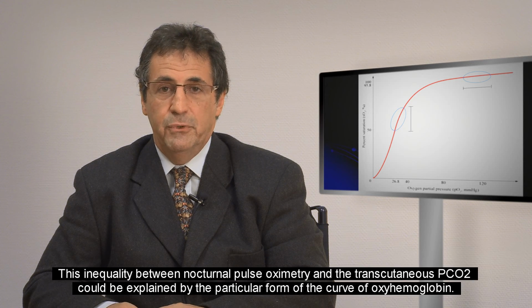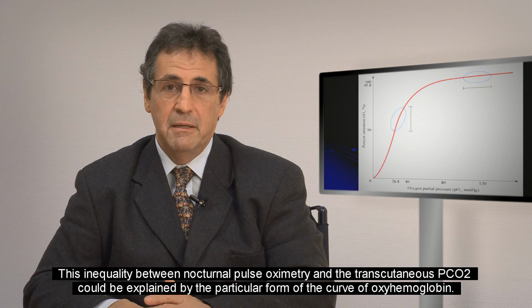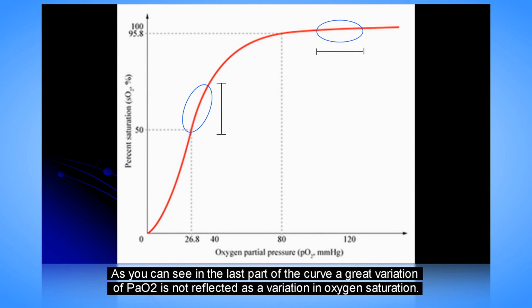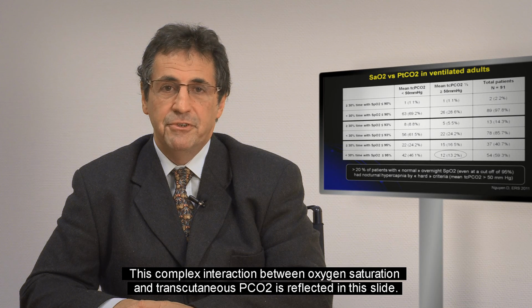This inequality between nocturnal pulse oximetry and transcutaneous PCO2 could be explained by the particular form of the oxyhemoglobin curve. As you can see, in the last part of the curve, a great variation of PaO2 is not reflected as a variation in oxygen saturation. So, if a patient has a high level of PaO2 during the night, oxygen saturation is not a sensitive tool to evaluate ventilation. This complex interaction between oxygen saturation and transcutaneous PCO2 is reflected in this slide.